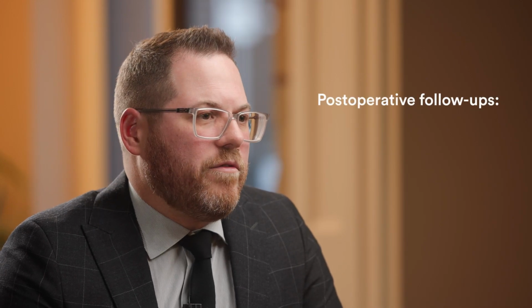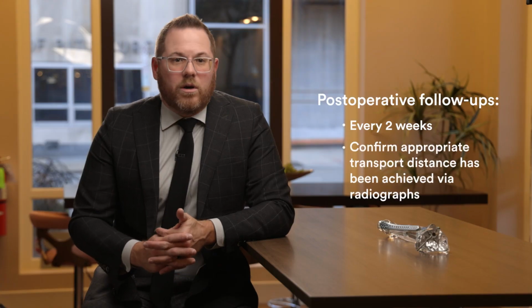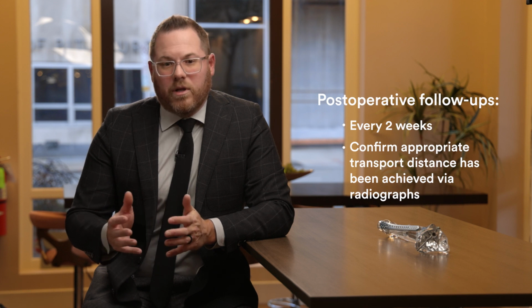So postoperatively, the first visit occurs at approximately 2 weeks, which is standard. So radiographically, we're able to look at various parameters on the radiographs to determine that the nail has moved appropriately. And so we can look at the area in the magnet as well as the distal nail. We can take those measurements on calibrated x-rays and confirm that it has moved the appropriate amount based on the number of cycles performed.